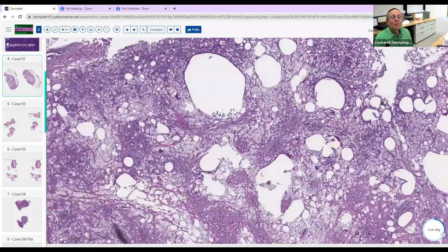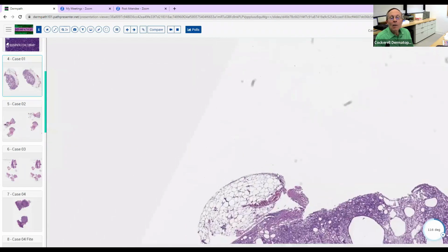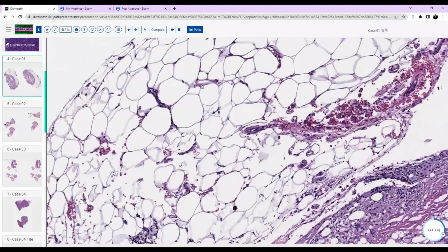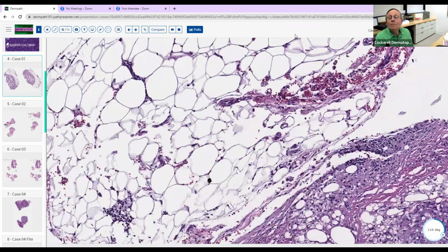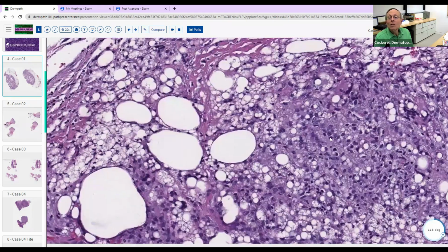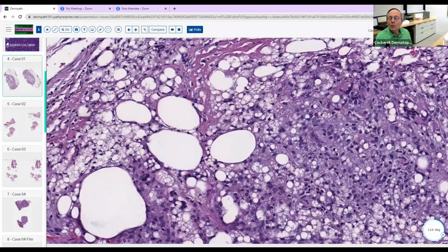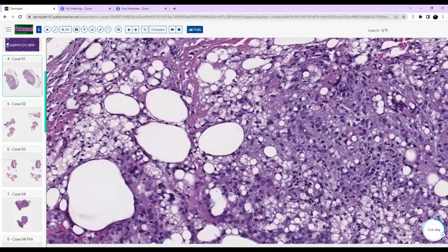Let's take a look at the other area. What have we got over here? So those are adipose with, yeah. Normal fat cells here. Okay, good. And then what are these cells here? Let me see. Oh, those are inflammatory cells. Yeah, good. What kind of inflammatory cells? So mostly lymphocytes. These are probably lymphocytes, these small dark cells.